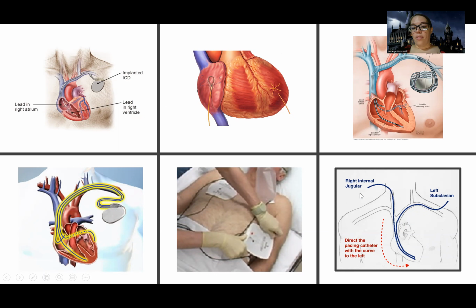We also have what's known as a transvenous, which is another temporary. So they can go to cath lab and have an internal, temporary pacemaker through the vein, and through a central vein, you can see here into the heart. This helps for patients that maybe are in cardiogenic shock or have something really serious going on that they're going to need a pacemaker, but they're not stable enough to go get one. So we'll put this in temporarily. There's also this one up here, which is what is known as epicardial, which is on the outside of the heart's pacemaker.